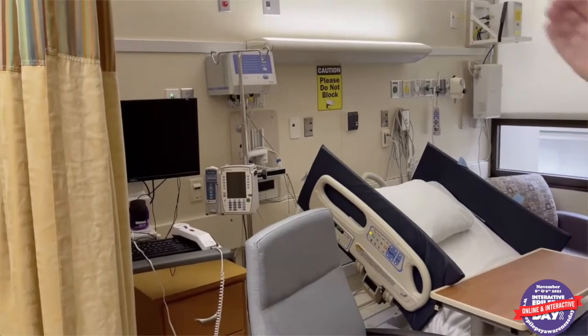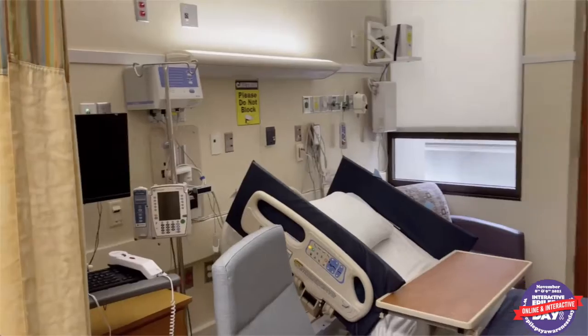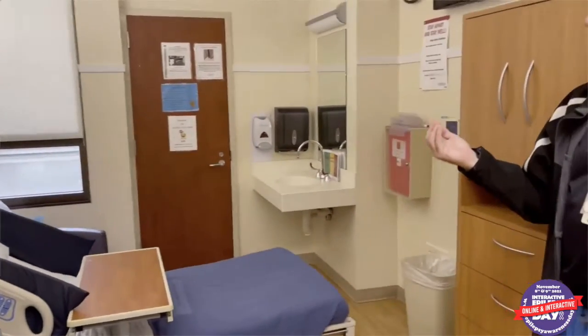We also have an IV pump and pole because some of our patients may decline to a point where their seizures are not under control anymore, and they may need to be brought back to normal by giving medication to help cut the seizure. If the patient has had too many events and the medication is not enough, or we want to reestablish a proper level of medication, we give it intravenously. And that's what we use it for. Also, we may have patients post-op in this room, meaning that they surgically removed the focus of the seizure. Therefore, they need a day or two of antibiotic before they head home.